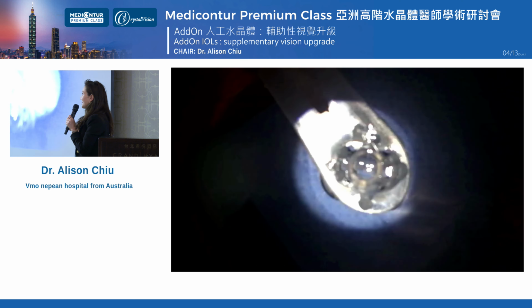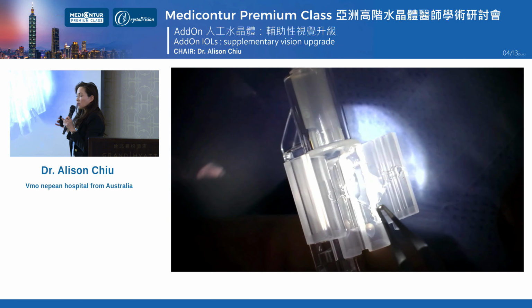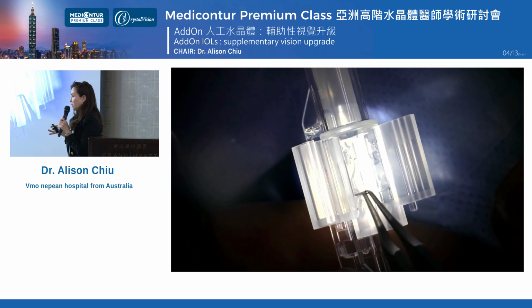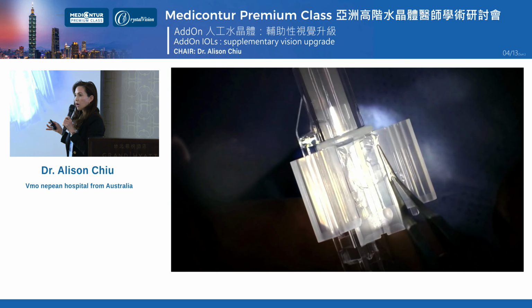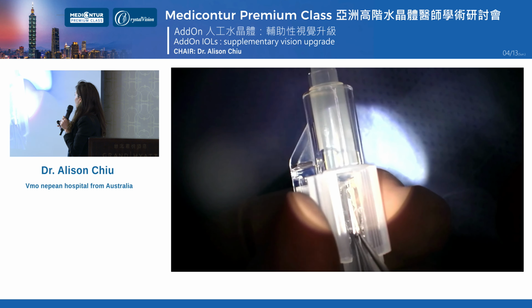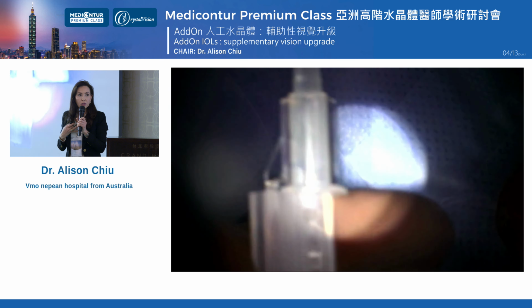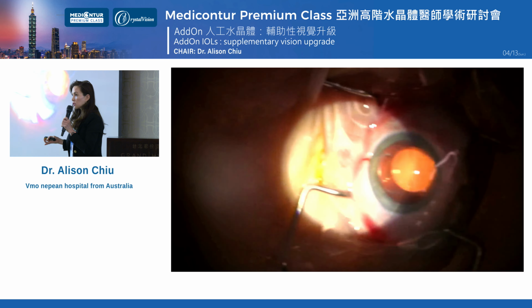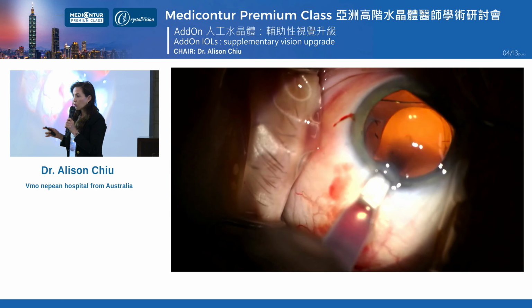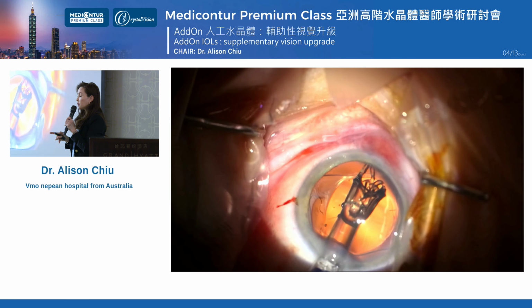So one of the things you'll get to do today is practice loading the lenses, and I think it's really important to, there is a bit of a learning curve with that, but really the main tip I have for you is be careful with the haptics. Make sure that you tuck them underneath the little flange. And usually I do load this lens myself. There are some surgeons that load all their lenses. I don't load my other in the bag lenses, but this lens I load because the haptics are crucial to get right, and it's not hard to get it right.